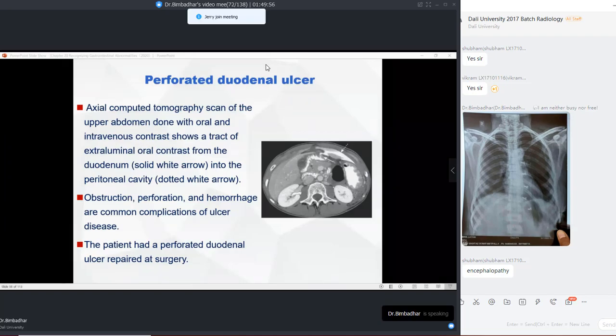Just give it a try. There is nothing serious in this one, but still, you have to think out of the box. Don't look at that X-ray, because that X-ray is quite normal. No abnormality is present in that one. But after I looked at the head CT, chest X-ray, the vitals and the case sheets, I just asked one question, and that explained everything to me. And I was completely able to diagnose the case and treat better.